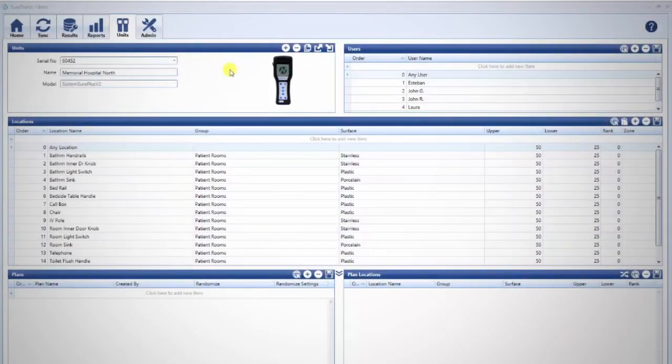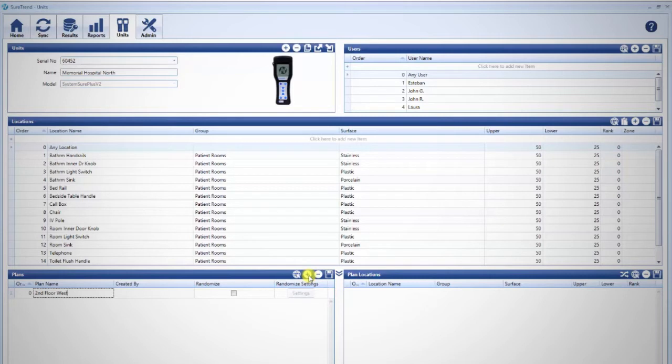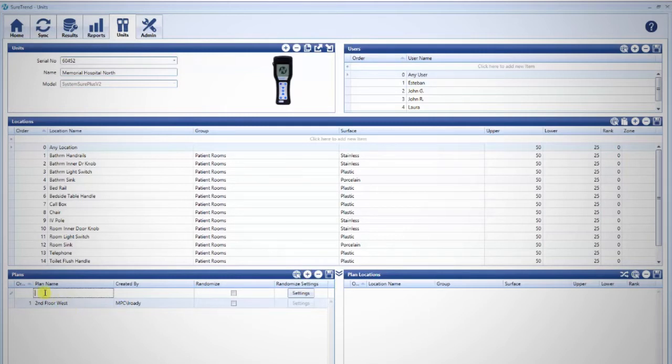To make a test plan, navigate to the Units tab and click the plus sign in the Plans pane. Name the plan and once completed, press Enter. Hygiena Luminometers display up to 20 characters for the plan name. You may also click into the empty box under Plan Name and start typing, then press Enter when finished.